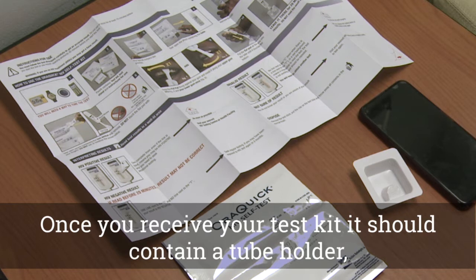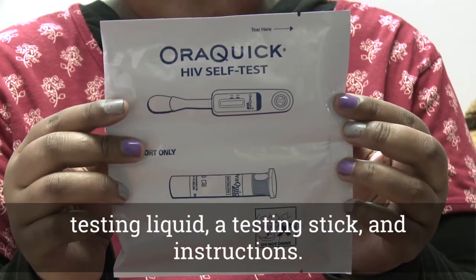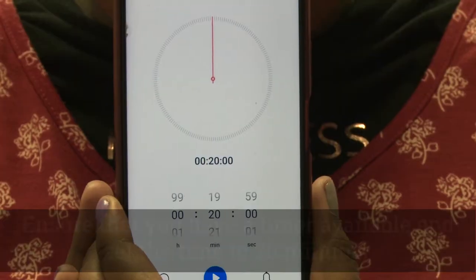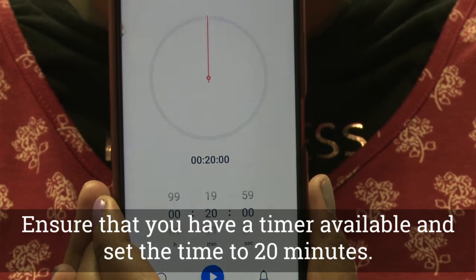Once you receive your test kit, it should contain a tube holder, testing liquid, a testing stick, and instructions. Ensure that you have a timer available and set the time to 20 minutes.